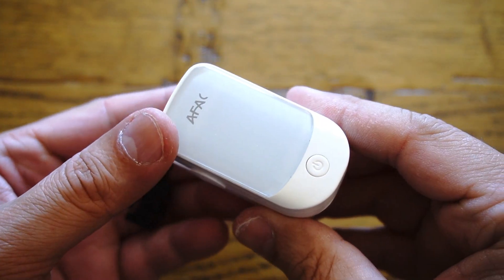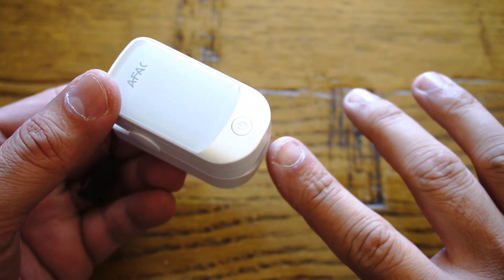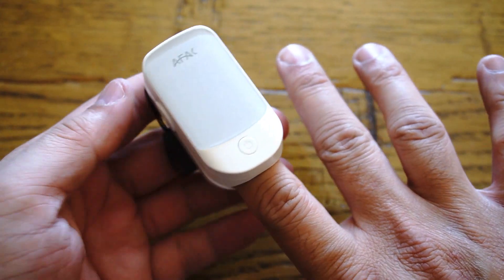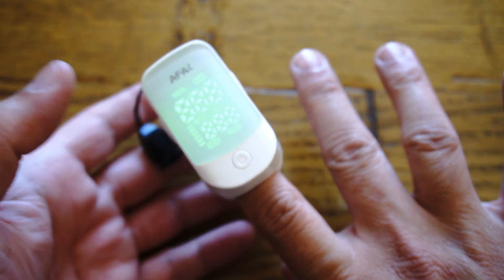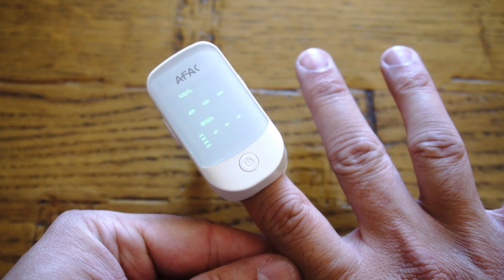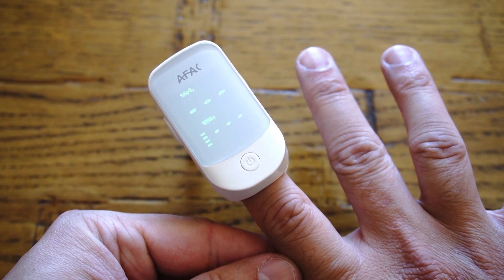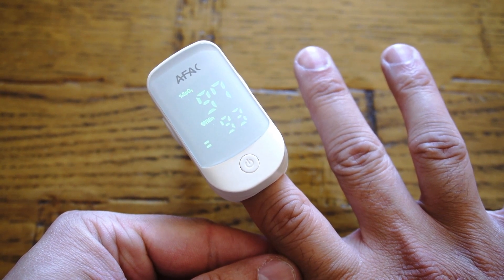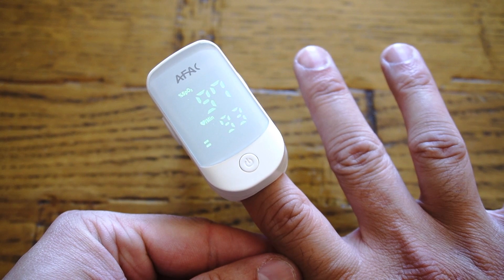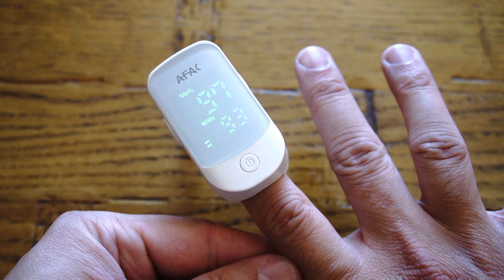This pulse oximeter by AFAC is capable of recording SpO2 oxygen saturation ranging from 0 to 100 percent with a resolution of plus or minus one percent, whereas the pulse rate ranges from 25 to 250 BPM with an accuracy of plus or minus one BPM. That's not bad at all in terms of specifications.